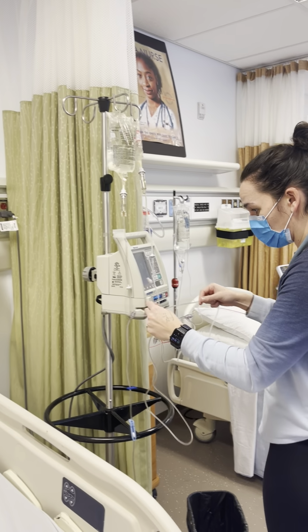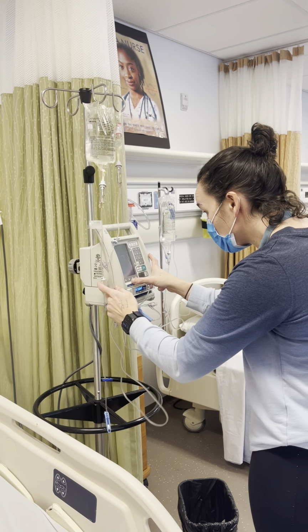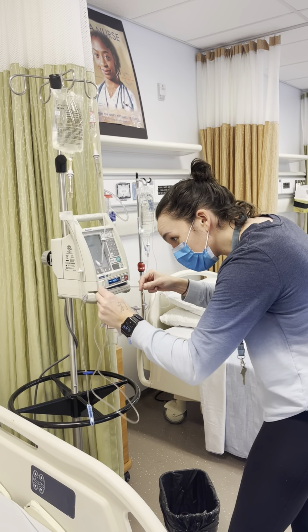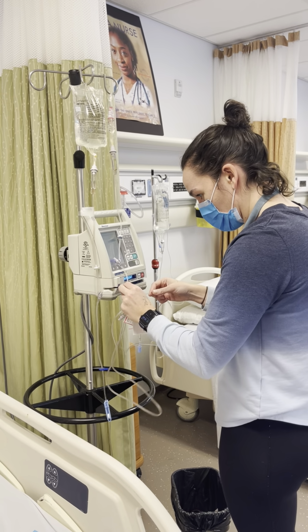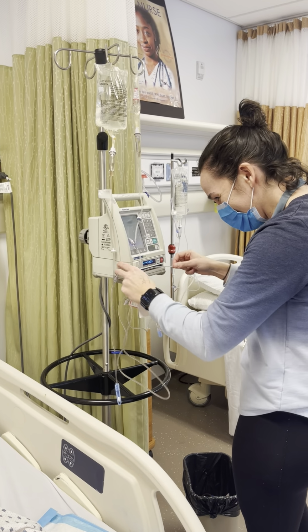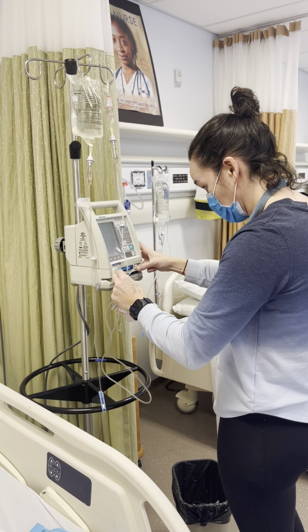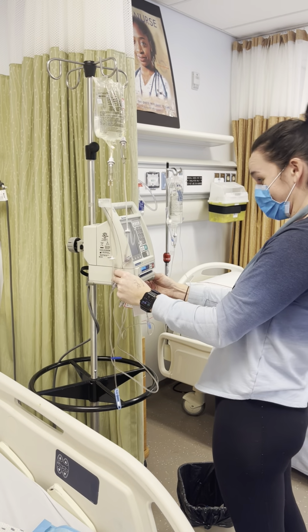Select milliliters per hour. There we go.